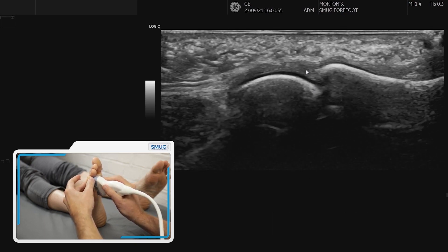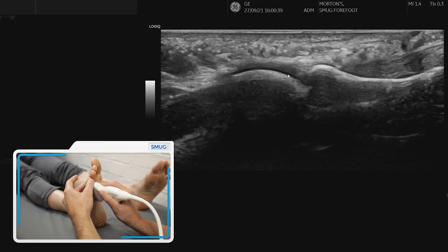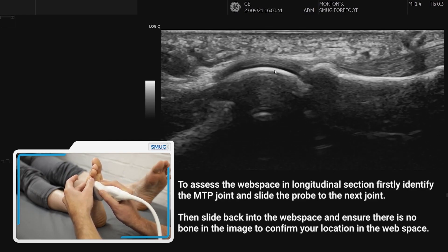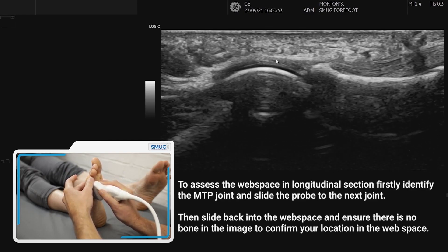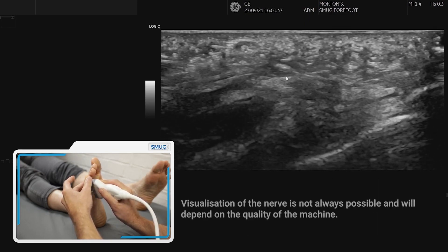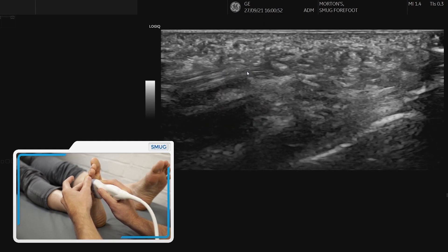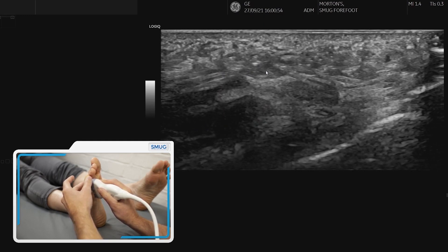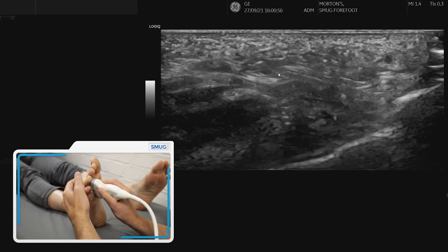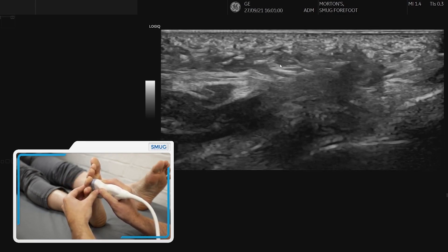We're going to move laterally to the fourth metatarsal phalangeal joint and interrogate the structures there. If we move back into that intermetatarsal space where there are no bones, we can sometimes identify the nerve. We also need to do a compression to determine whether this is a neuroma or a bursa.